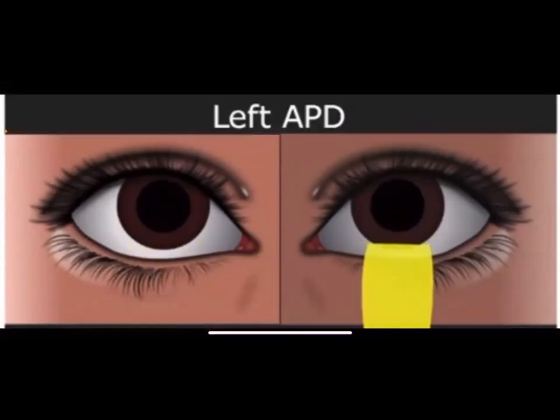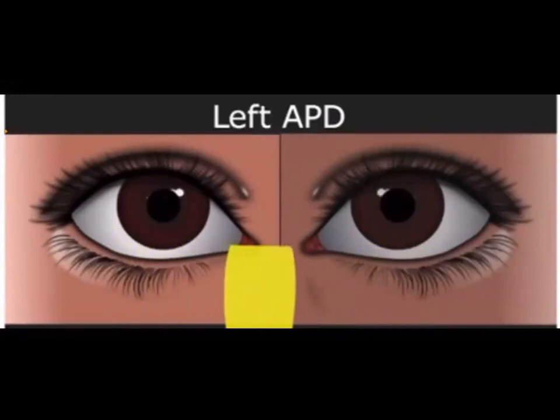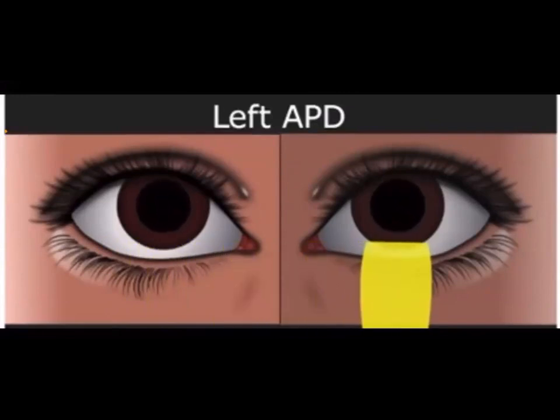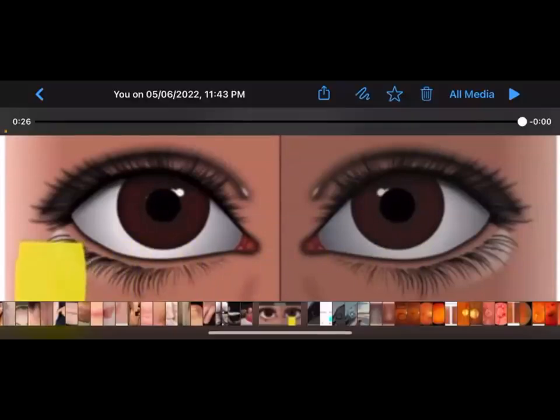So I will repeat the video again. Dilate. The pupil dilated instead of constricted. Is it clear? So this is how to test for the swinging light test. What is the benefit? Because if there is any optic atrophy, I would want to know this before starting my fundoscopic examination.